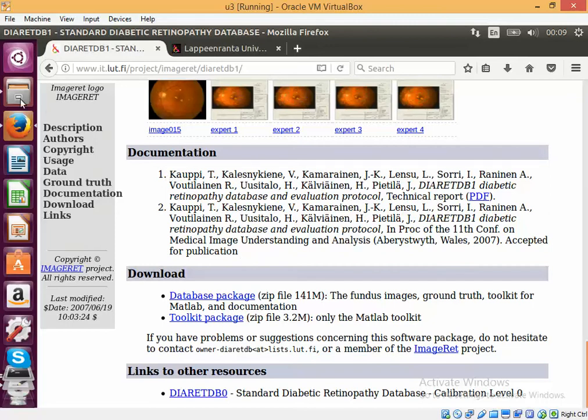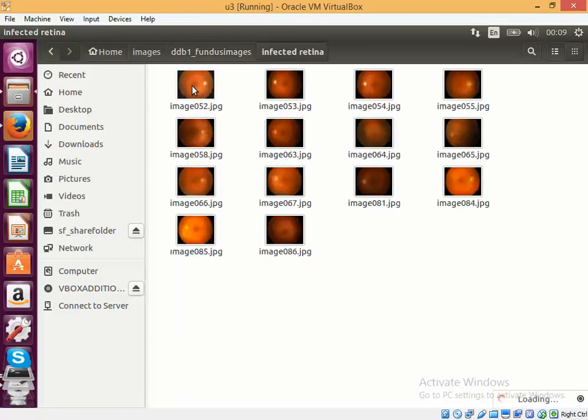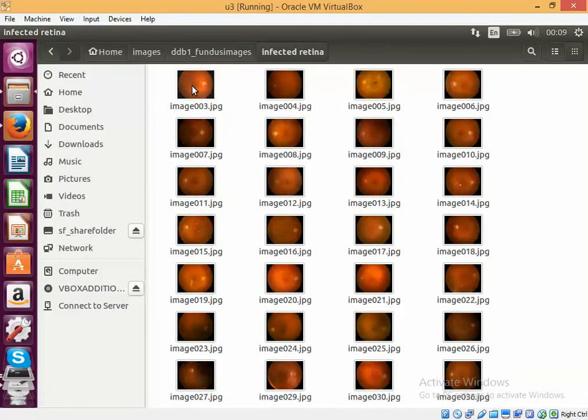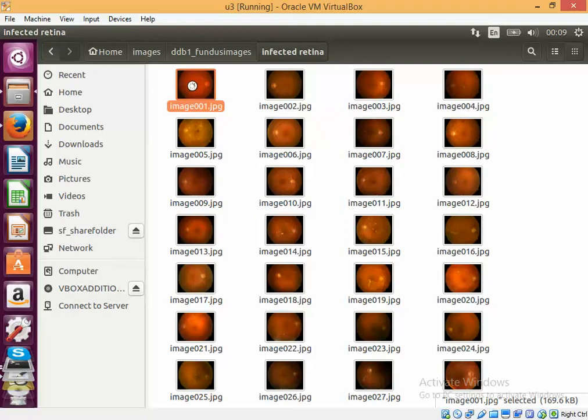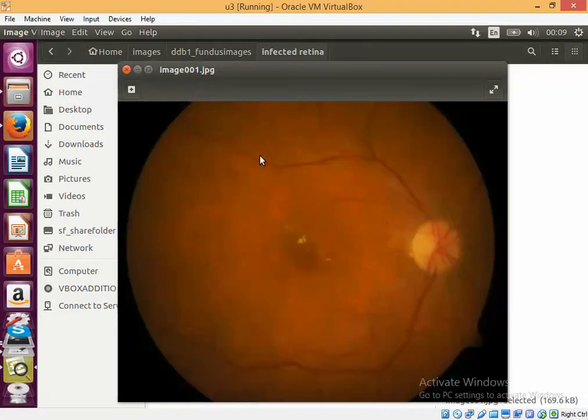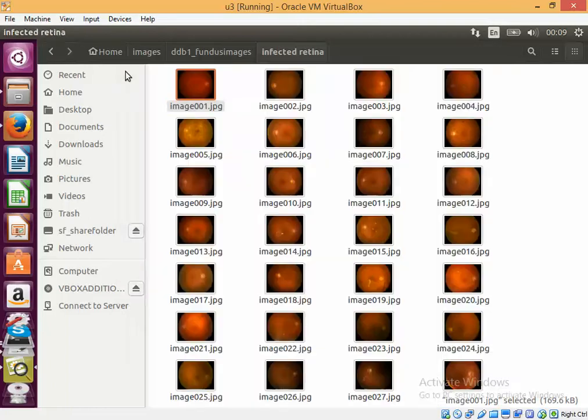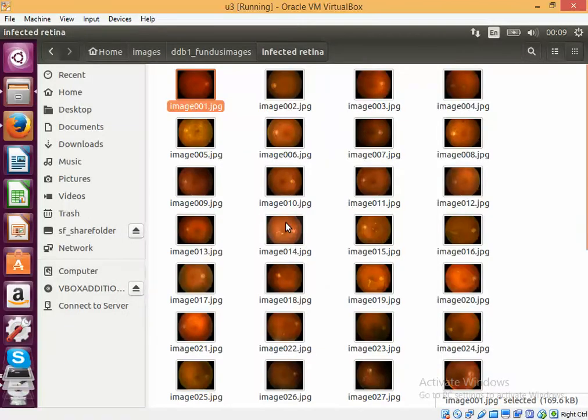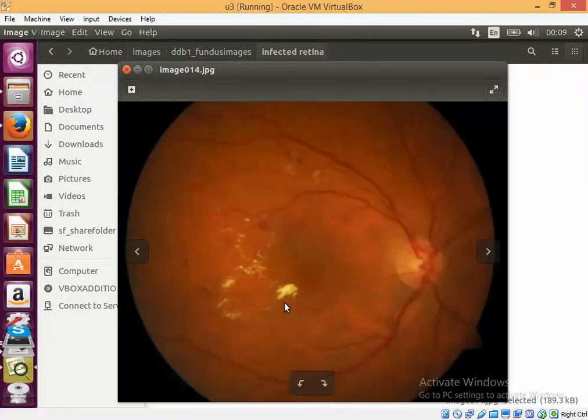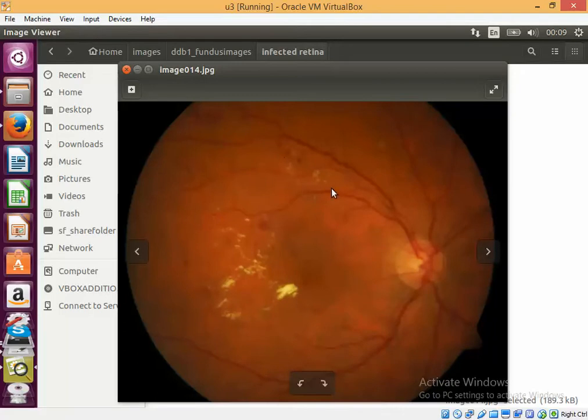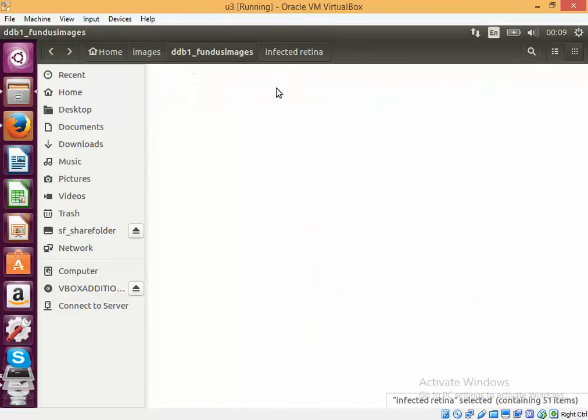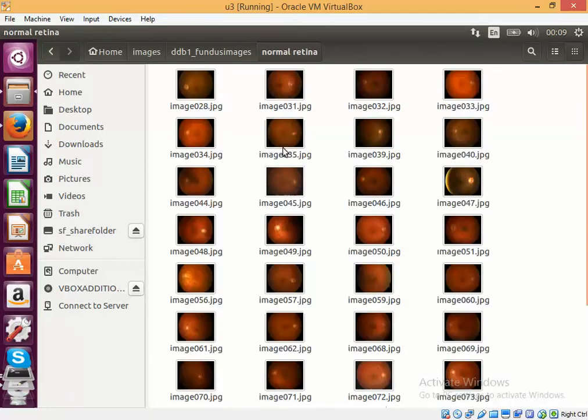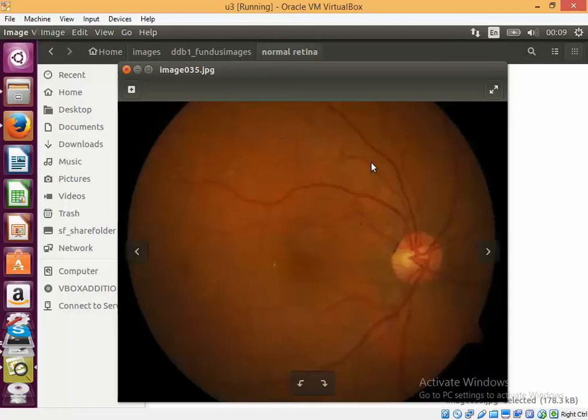So I have downloaded the images and if you look at those images these are the kind of images that are visible. See, this is an infected retina. You can see that these are the spots, these are the spots and some hemorrhages that are visible. Whereas in case of a normal retina you don't see those spots, the retina is more or less clear.